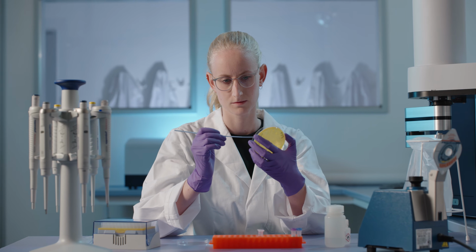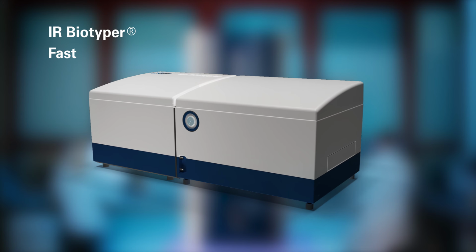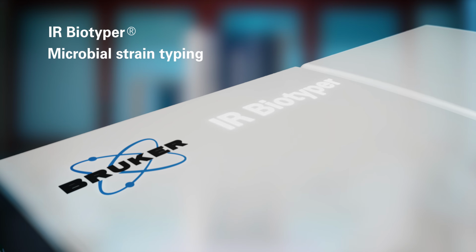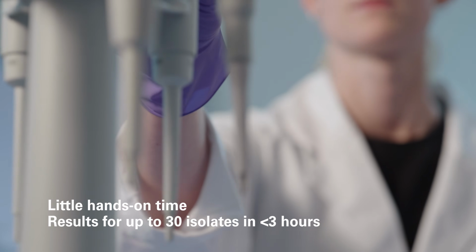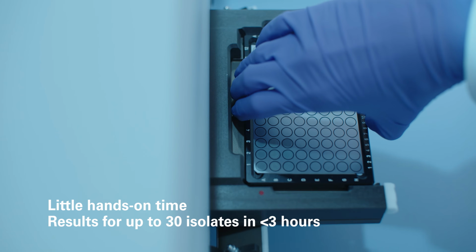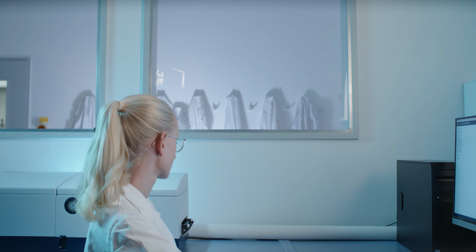To address this challenge, Bruker developed the IR Biotyper. This fast, cost-effective, and easy-to-use system applies infrared spectroscopy to classify microorganism strains with high specificity. After a straightforward sample preparation procedure that starts from a culture, the silicon plate is simply inserted into the IR Biotyper, and the analysis begins.